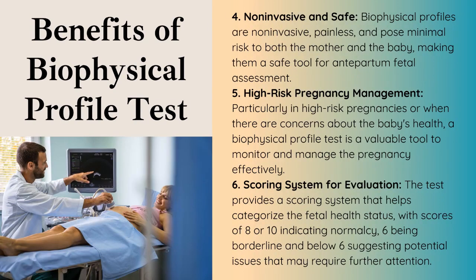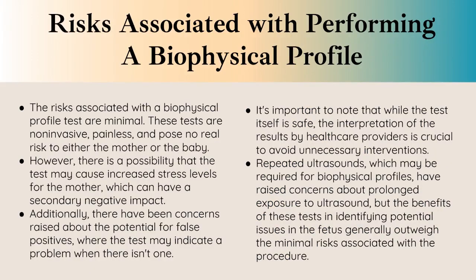There are many benefits to a biophysical profile. It's non-invasive and safe. It poses a minimal risk to both the mother and the baby, making it a safe tool for antepartum fetal assessment. It can be used in high-risk pregnancy management, particularly in high-risk pregnancies or when there are concerns about the baby's health. A BPP test is a valuable tool to monitor and manage the pregnancy effectively. The scoring system for evaluation: 8 to 10 indicating normalcy, 6 being borderline, and below 6 suggesting potential issues that may require further attention. Risks associated with performing a biophysical profile.